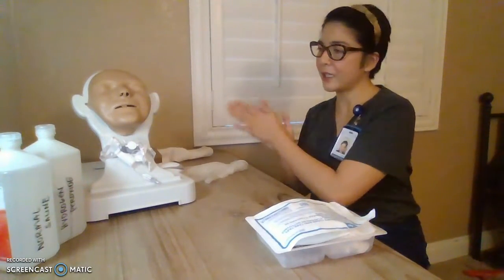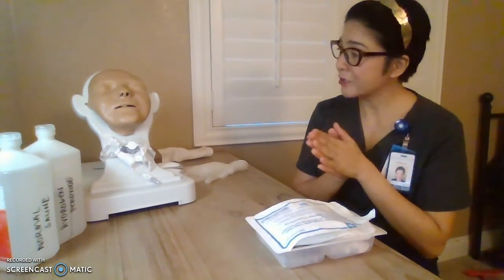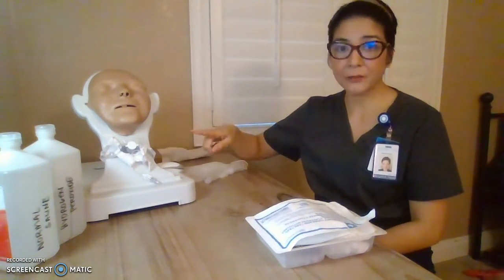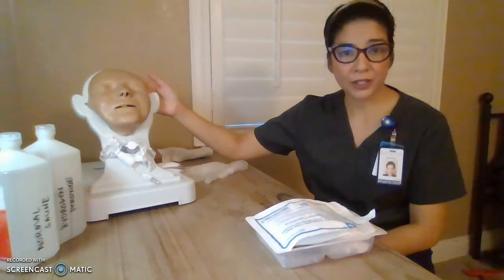Patient privacy, hand hygiene. Mr. Smith, good afternoon again. I'm here. I have my supplies. Is it okay if I start arranging my supplies? Thank you. So this is a good time. Again, assess your patient. Look at him. Look at his vitals. This is a good time to reposition your patient.